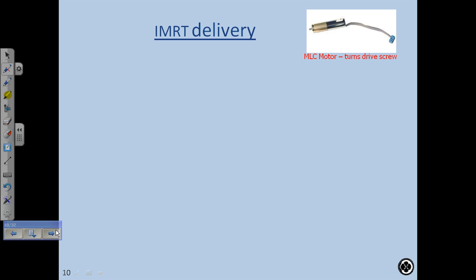I would not use a compensator for that application, just because the position of the hand relative to the compensator is going to highly affect the dose distribution. Right. And these are small structures, so if you don't get that right on, you could be doing more damage than you think. Yeah. Nobody understood why the doctor ordered it, but yeah, it did.